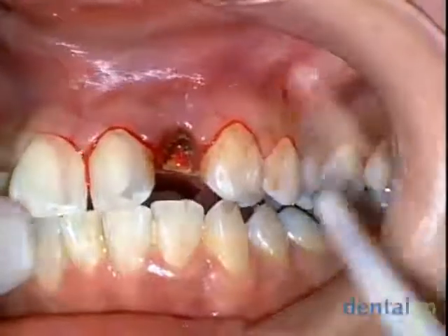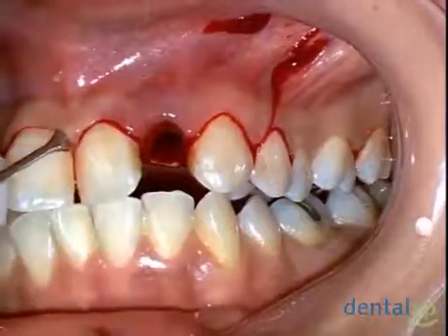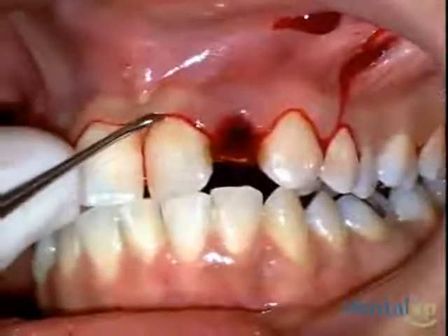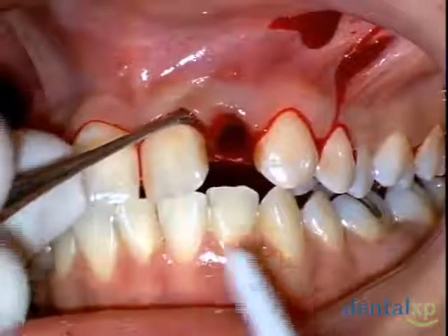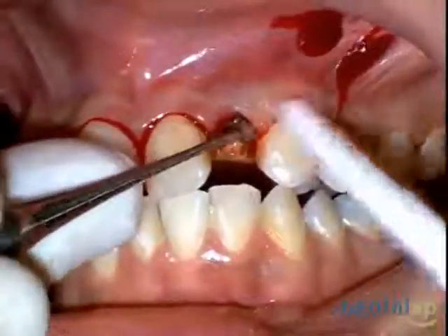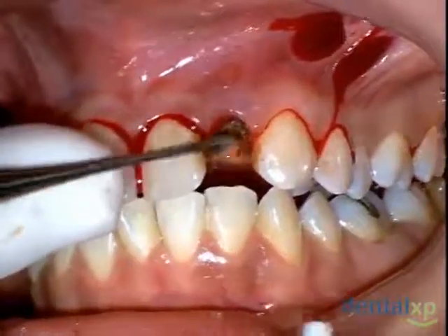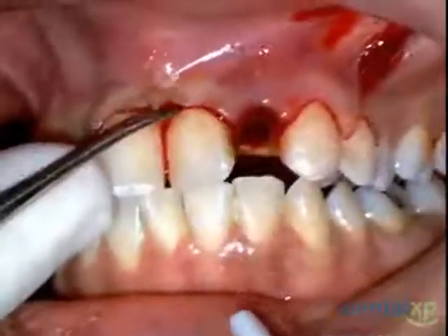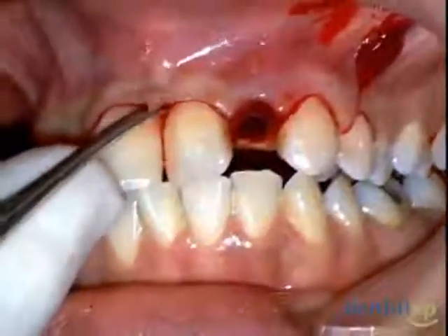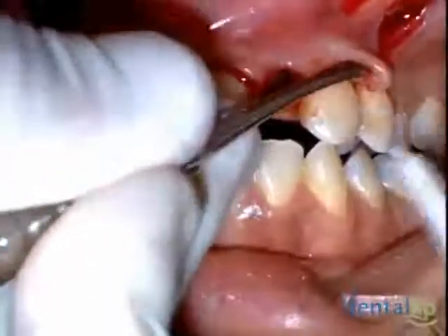I prefer to have at least 1.5 to 2 teeth on either side of the defect environment in terms of my flap dissection. This gives me a broad base to work in terms of vascularity and allows me to fully access the defect environment. I then use a microperiosteal elevator. This is a Boozer elevator to first lift up the interdental papillas, and then a microperiosteal elevator to begin the initial dissection of the flap.